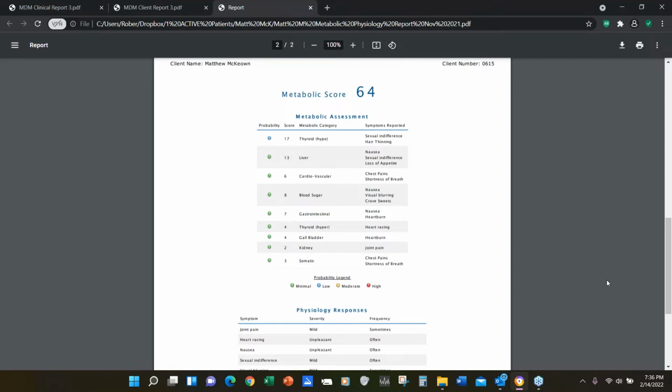Well, right here, what we've done is we took a large sample from hundreds of clinics around the United States, around the world actually, but I confined it to the United States because I didn't want cultural variations interfering with the data. I may have missed a few, but I tried to keep the samples mostly from the US and from all over the US. And then you run the descriptive statistics on the norm to see what the average score in the country was of people coming into neurofeedback clinics.